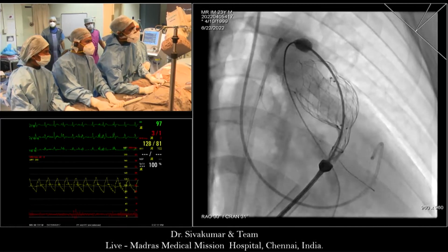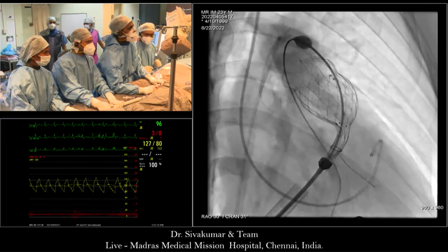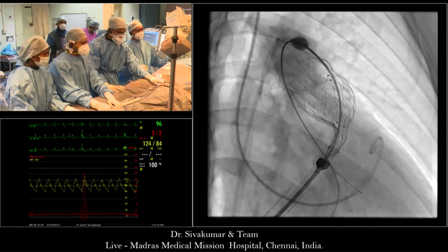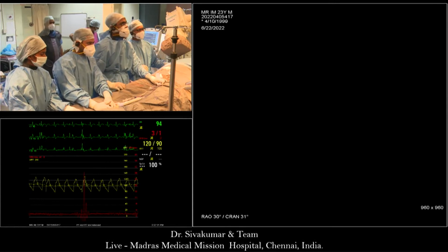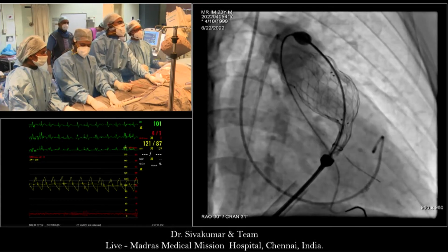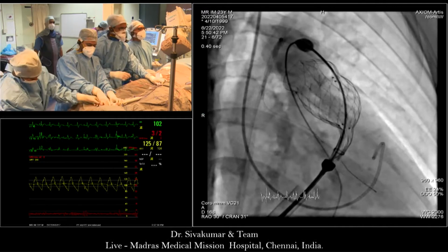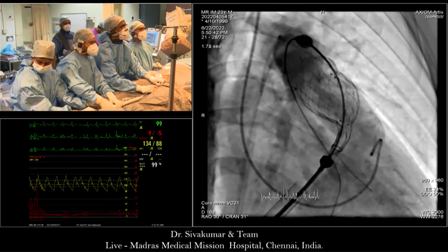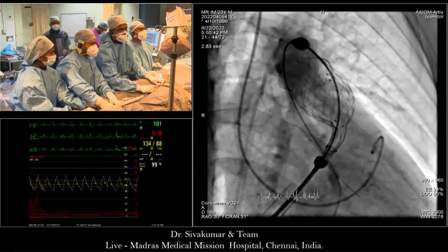Yeah. So release it, it's going to... Okay. I would do an angio before that final release in that projection. Okay. Now it looked a bit better. Get angio. Yeah. I'm happier now with the position because I think it's orientating itself. So if you keep a little push as you release.